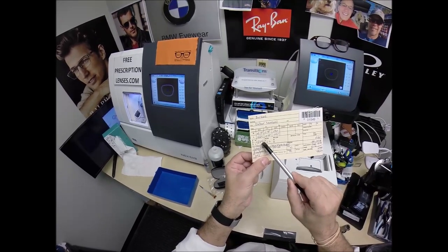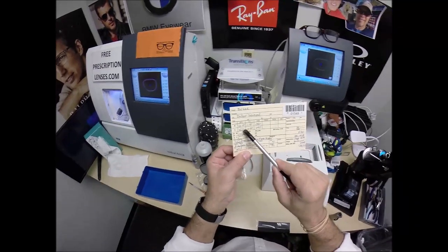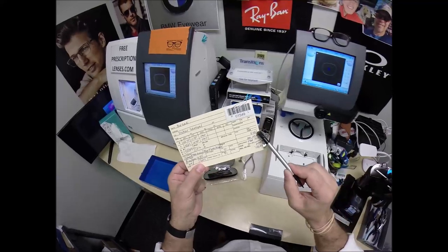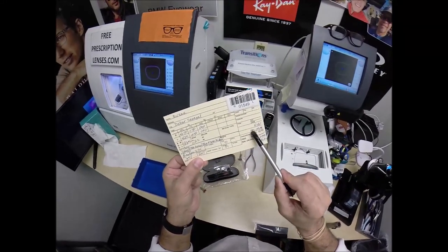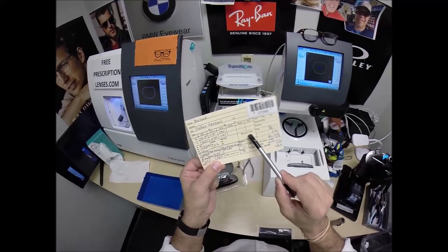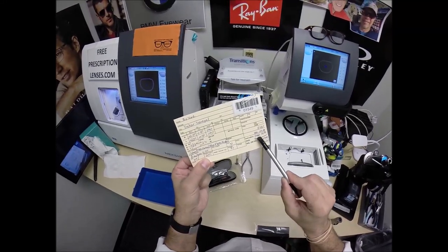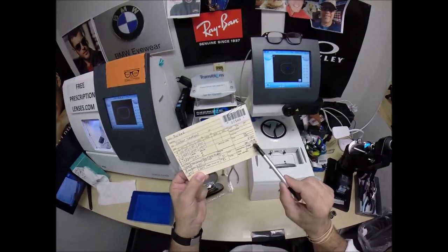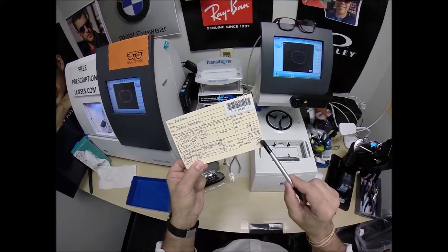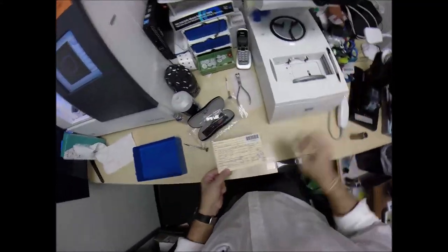You actually could wear over-the-counter reading glasses in a two and a quarter or 250, depending on whether you're right or left eye dominant. But you need another two and a quarter on top for your left eye, being a total of 450 — and they don't make over-the-counter reading glasses that strong. Now, this frame sells for $180. The progressive additional lens — the Essilor Ideal Advanced — adds $149.99. Transitions Extra Active in gray is $99.99. The blue flash mirror coating is $69.99, for a total of $499.97.